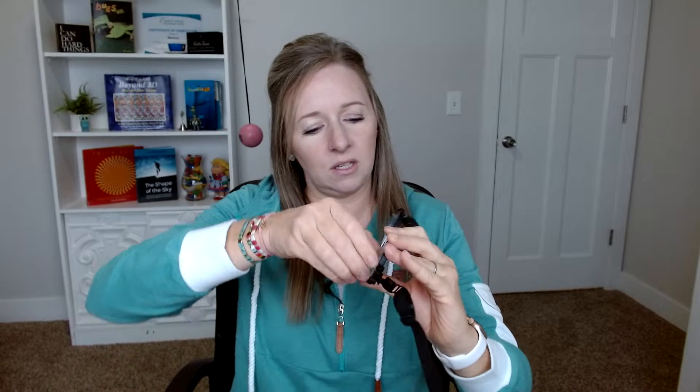Yoked prisms are a type of glasses that you have to get through your optometrist. Most people don't actually buy a pair — they usually just borrow them from the optometrist. Of course I had to have my own pair, so I bought these through my optometrist. You can untwist them and actually move the prism around in any direction — up, down, left, right — so they're really powerful in a lot of different types of exercises.